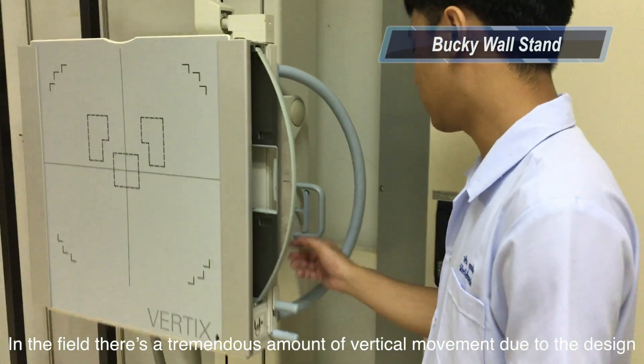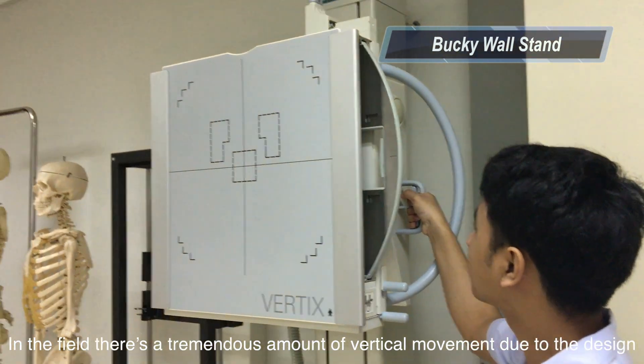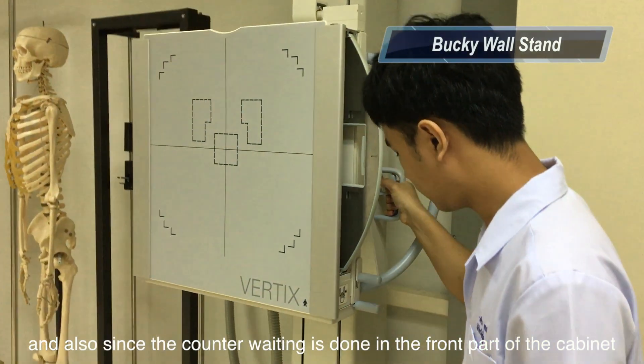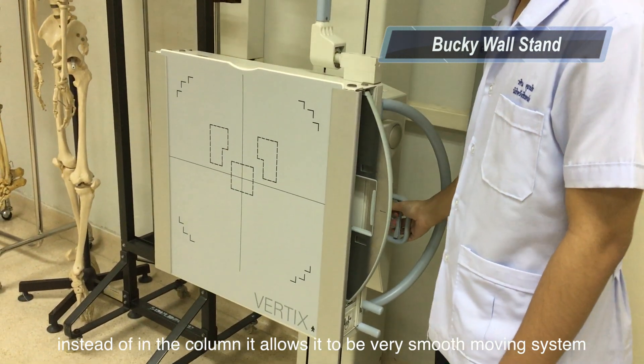There is a tremendous amount of vertical movement due to the design, and also since the elevating mechanism is done in the front part of the cabinet instead of the column, it allows for a very smooth moving system.